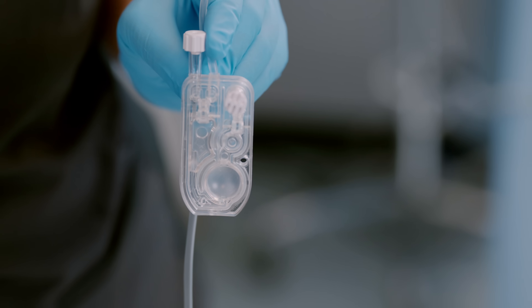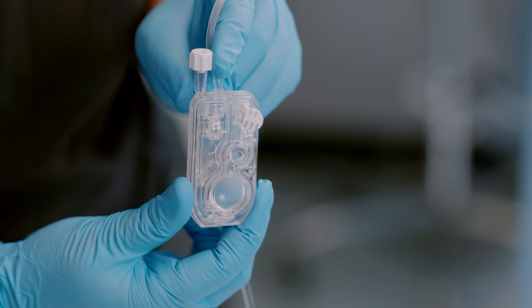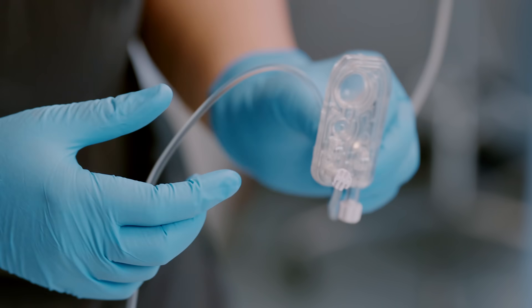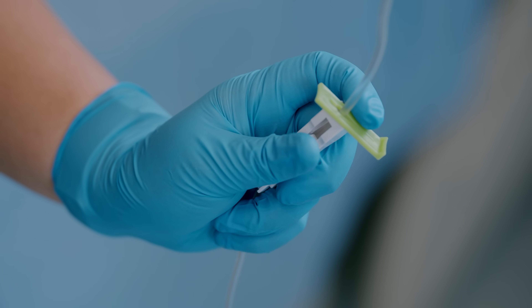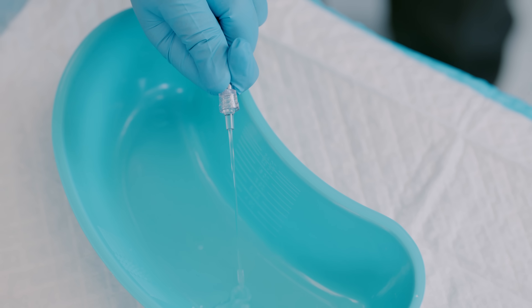Afterwards, what you do is called priming the IV tubing. This means you will allow the solution in the IV bag to flow through the tubing to remove air. All the air must be removed from the tubing to prevent an air embolism — that's super important.